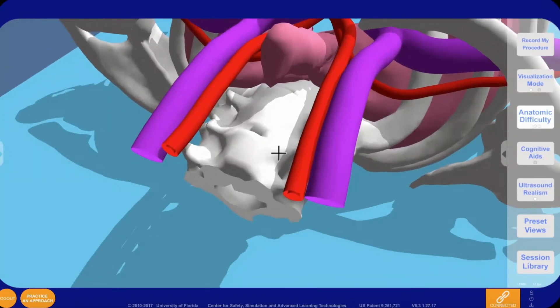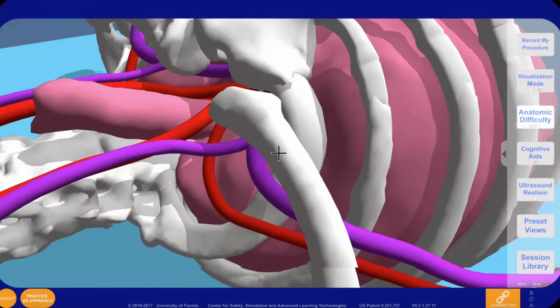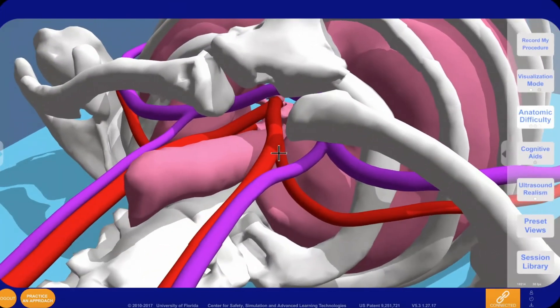The level of difficulty can be varied by increasing or decreasing the diameter of the veins. This can simulate patient position or hypovolemia.